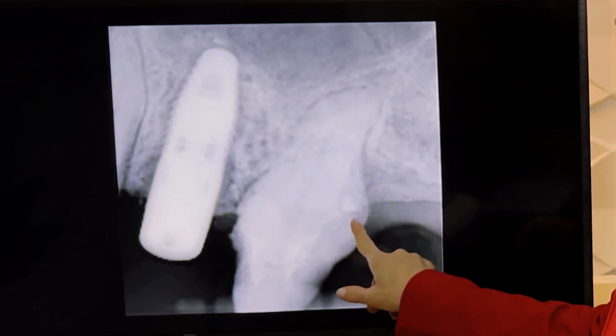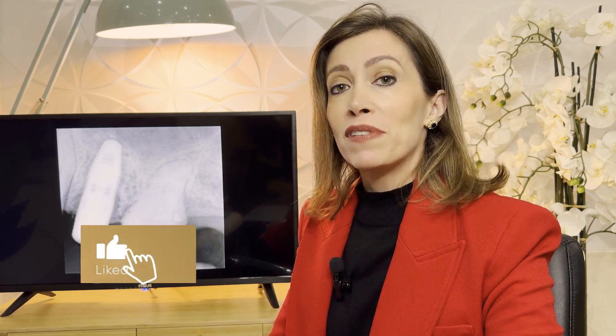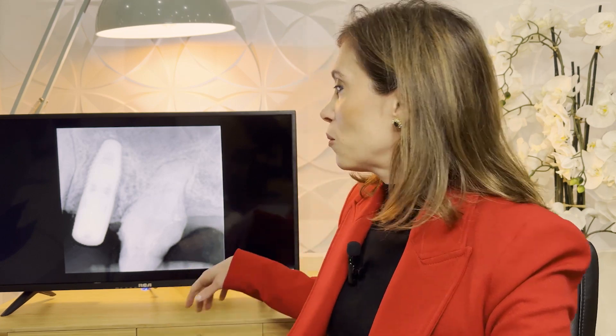When we see a case like that, the main thing we need to check is how many roots. So we can see that root, but is it a single-rooted tooth or not? A CBCT would have told us how many roots there were. This case I did prior to the CBCT, so I couldn't count. The main thing then is to access the tooth and try to find at least three or four canals — that is a normal molar situation.